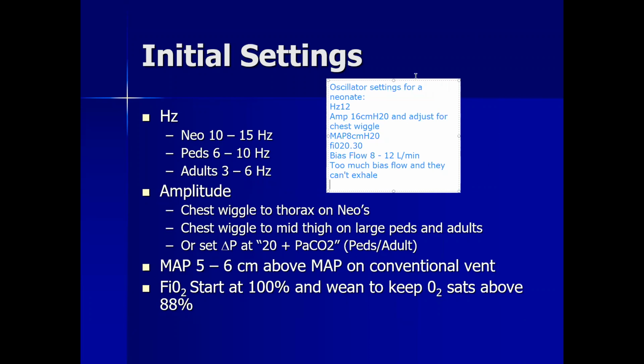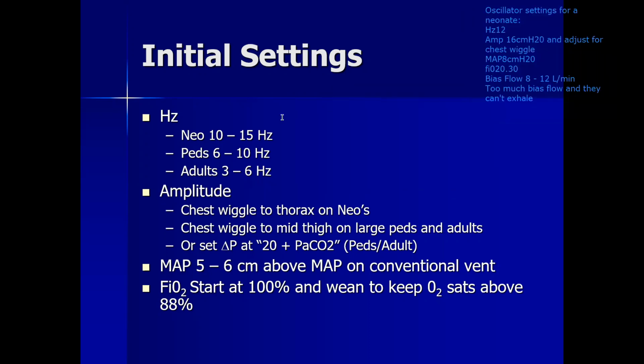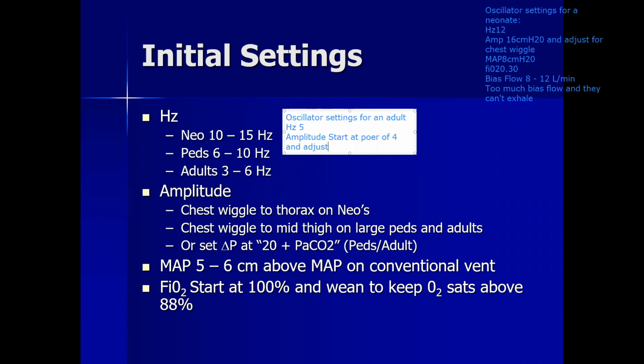Okay, and then for the adult, move this somewhere. So here it doesn't give us the amplitude that we're shooting for.